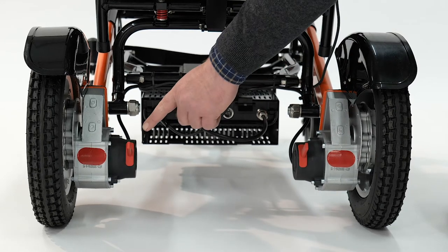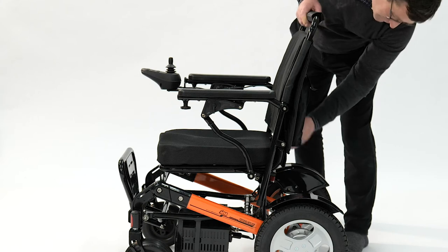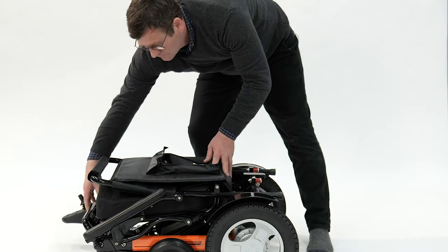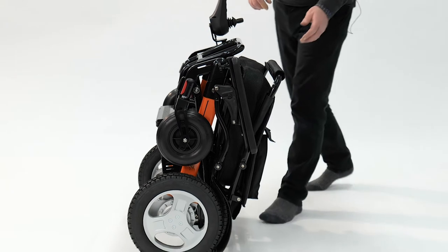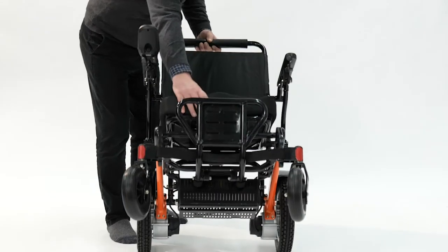Here are your freewheel levers. Fold your power chair using the lever at the rear of the seat. To open your power chair, hold on to the back, push away at the front and lock into place.